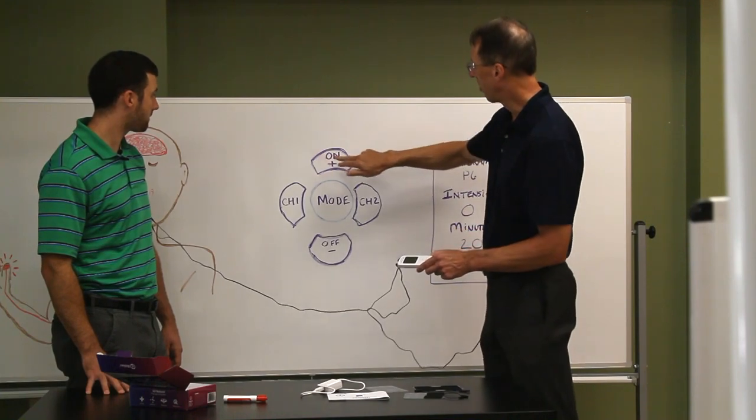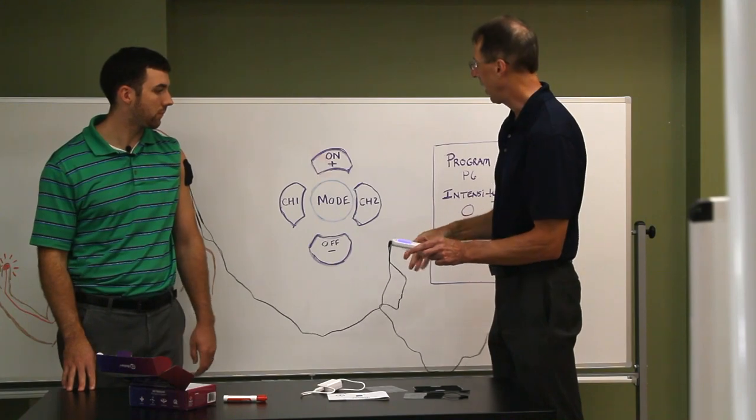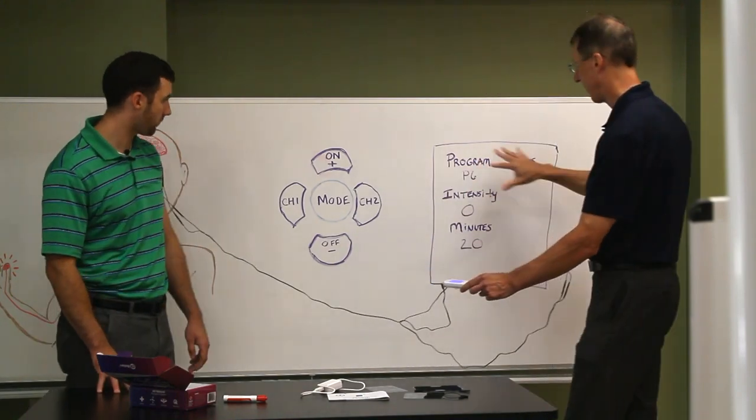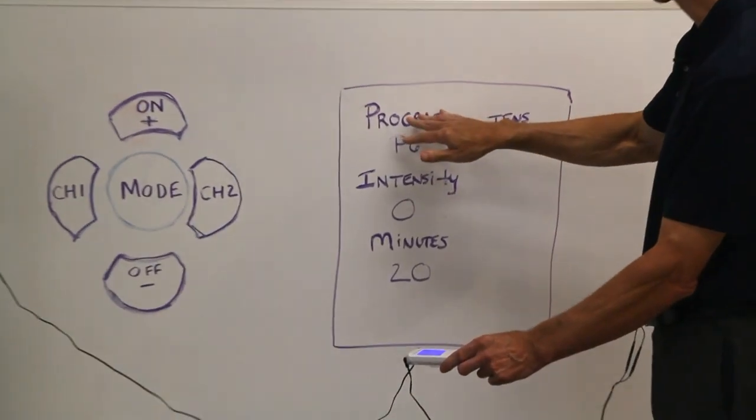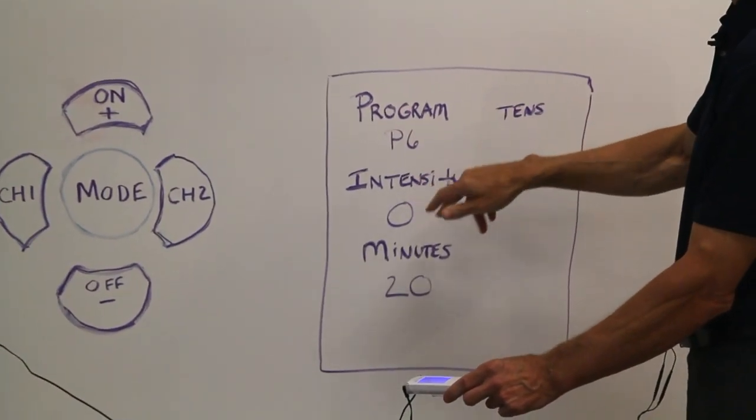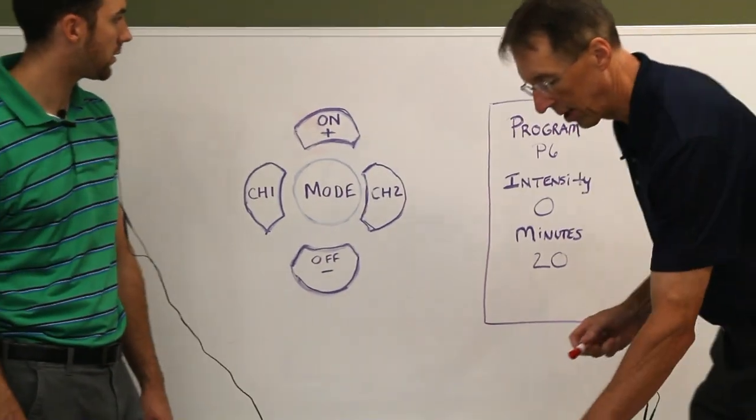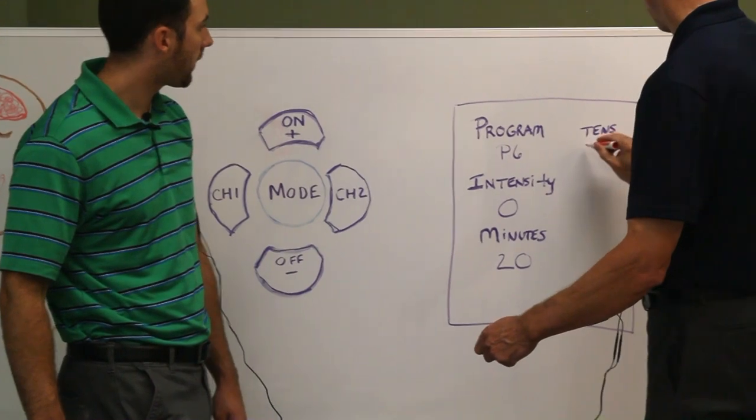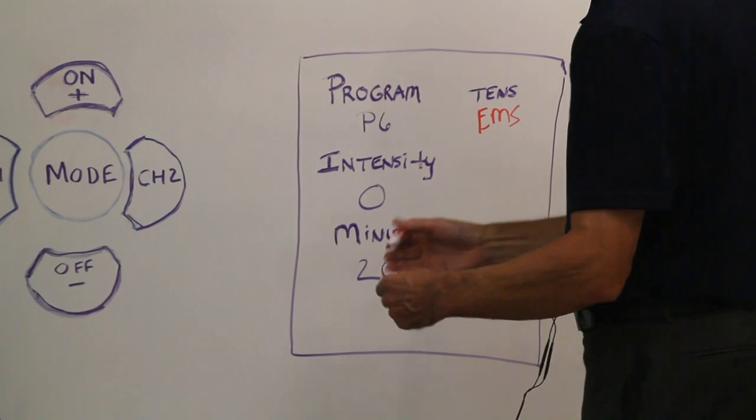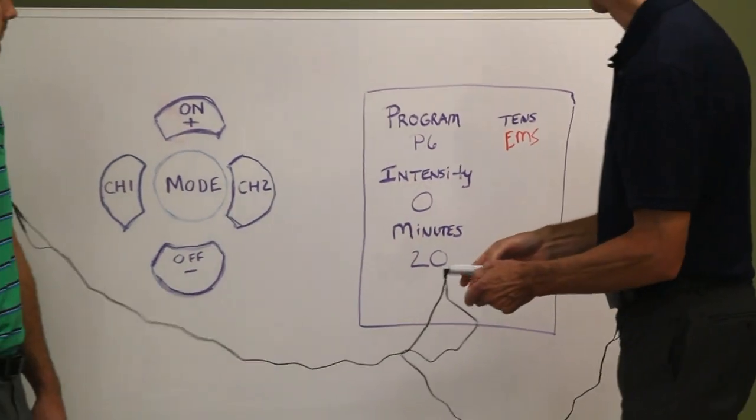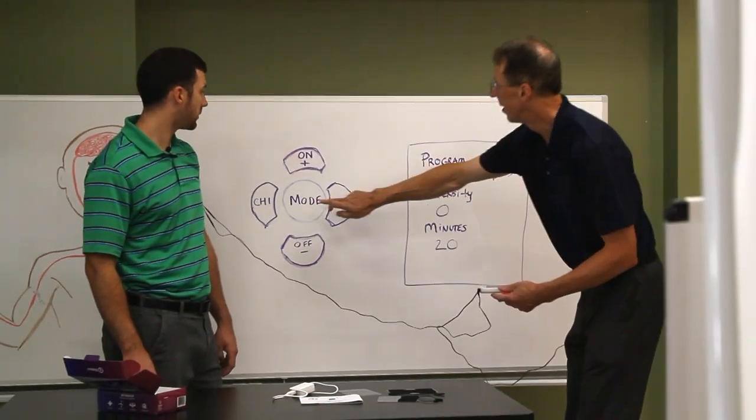So anyway, what you're going to do - you're going to go ahead and you're going to push the on button and hold it for three seconds. I'm going to do that right now. And up pops this screen. And you're going to see program, P6, intensity. Well, program you're going to see in a number, intensity zero, and minutes. And right up here actually it's going to say TENS and EMS, electrical muscle stimulation. And what you can do, it's going to say one or the other, and you can actually hit mode.